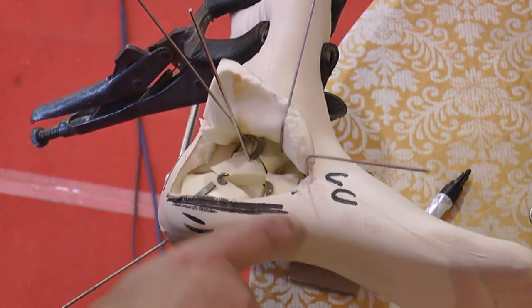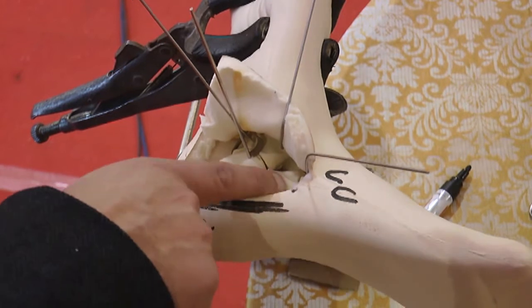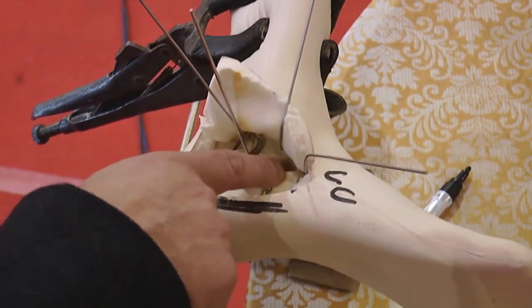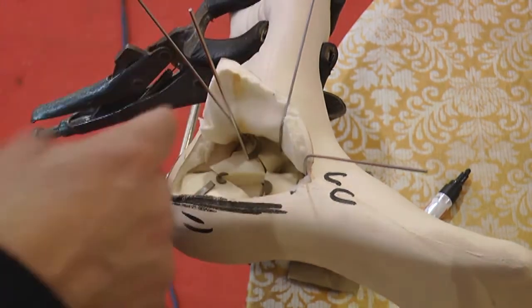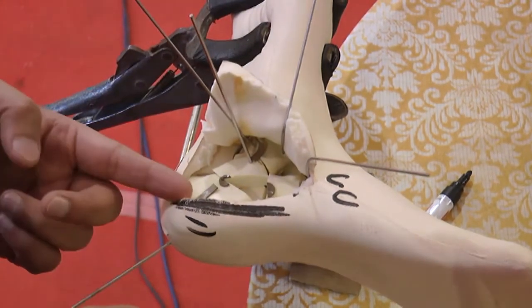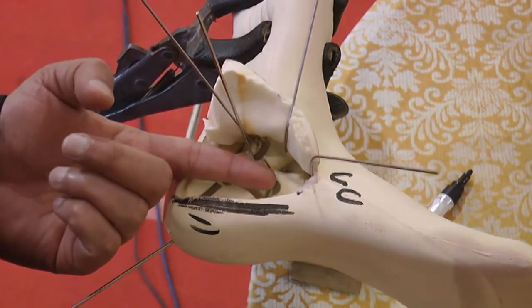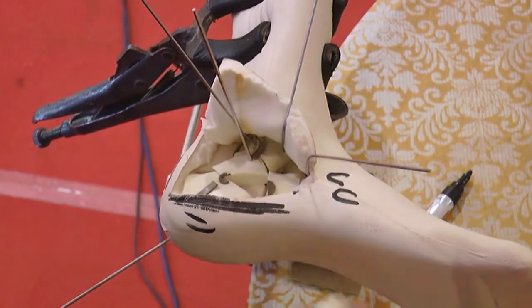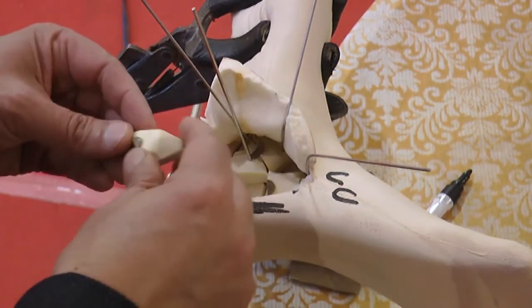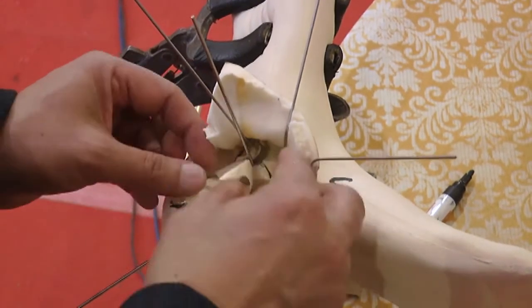At this stage, you need to look at the calcaneocuboid joint, and if there are any fragments or steps there and you need to put additional K-wires to stabilize them, you will do that. You can also, if your tuberosity has more fragments, fix the tuberosity to the anterior process by a separate wire before depositing back your lateral wall blowout, and then finally the plate goes in.